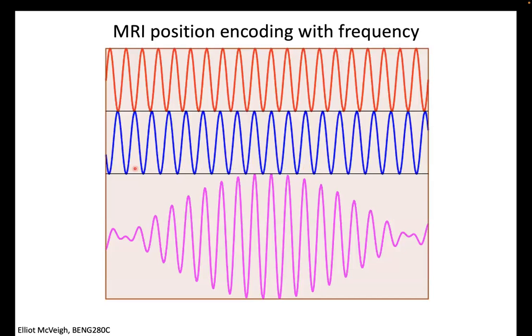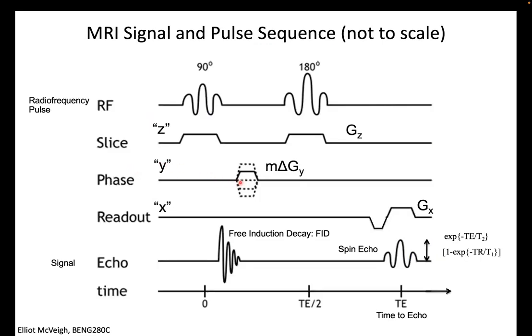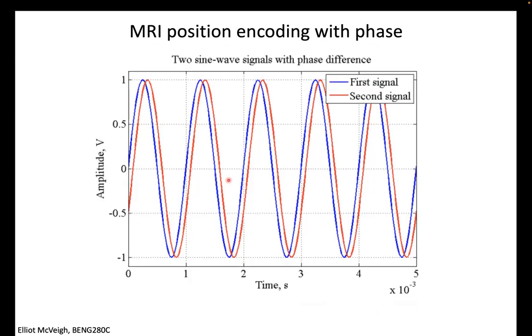And then I do another acquisition, a second acquisition, in which I pulse this gradient and ask, well, when I'm reading out over here for this magnetization vector, what does it look like? Well, it starts with a phase shift, right? And so you can see it's shifted for the whole thing.